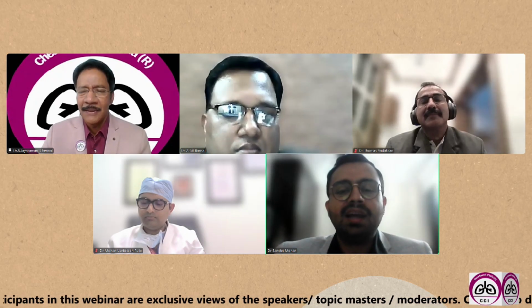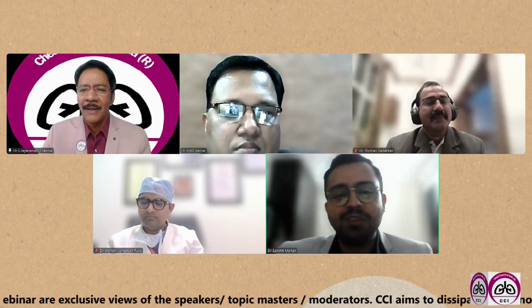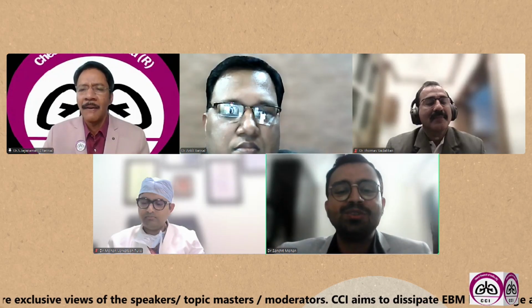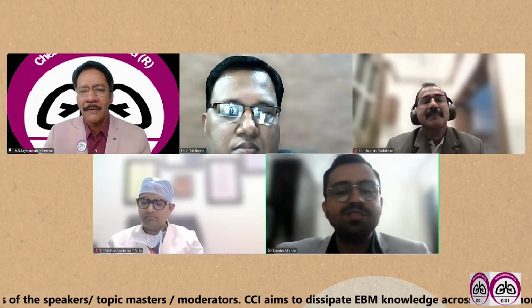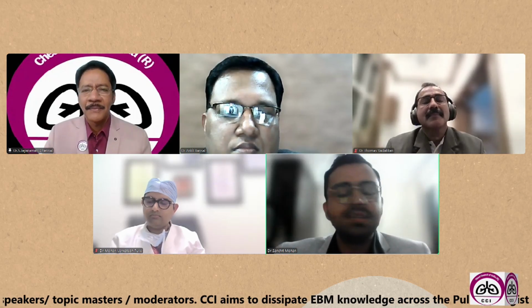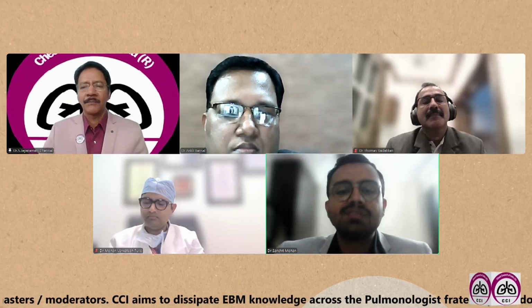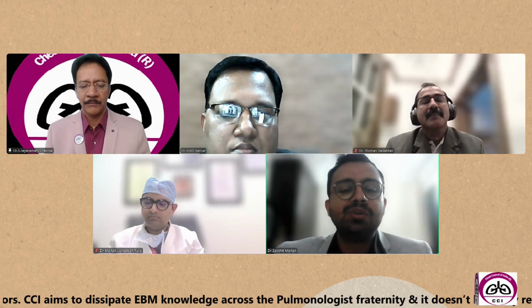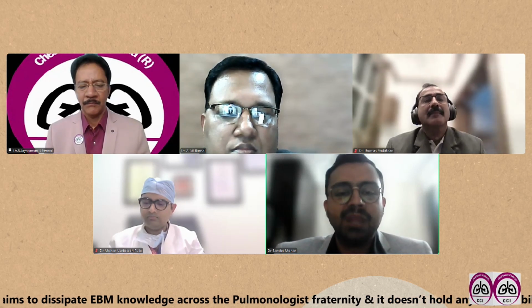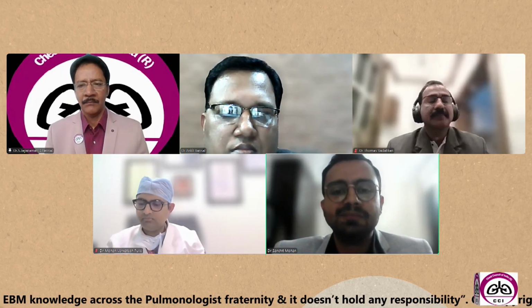So I'll suggest all the beginners to start using the left hand first. Give pain to your left hand so that you identify all the landmarks, identify all the vessels. Once you have identified the vessels, your work is done. Your complication rate goes very down, and your identification of the lymph node is amazing. You can easily diagnose which lymph node, and you'll never mislabel it.